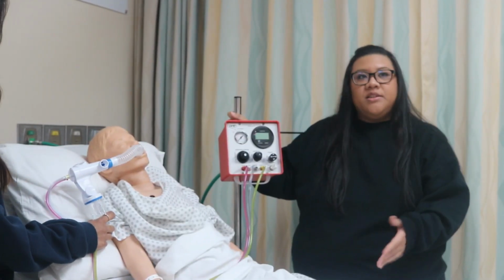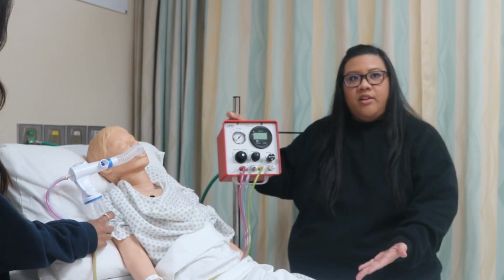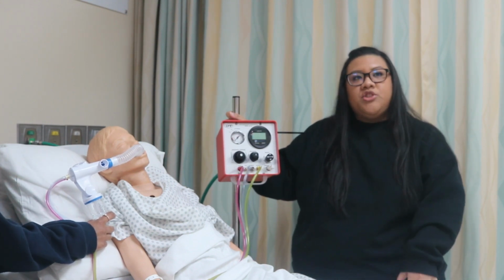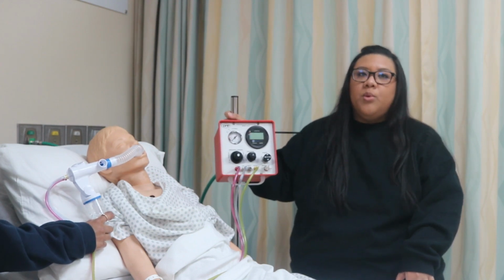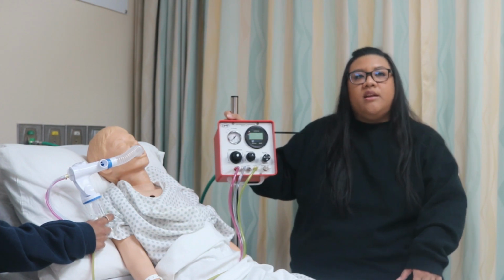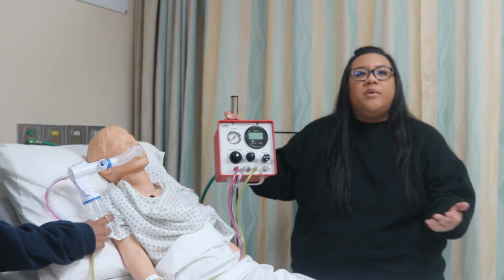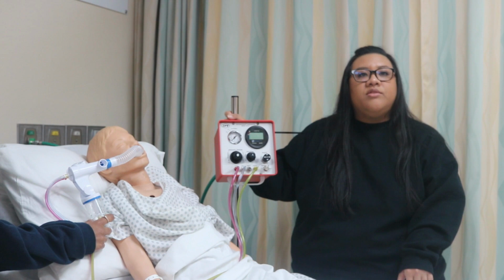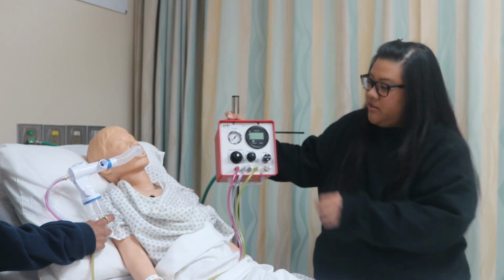Alright, so I'm going to give you guys a little demonstration. You want the patient to be in a semi-Fowler position. You want to instruct the patient to have a secure seal over the mouthpiece and breathe normally through the treatment. If the patient cannot maintain a tight mouth seal around the mouthpiece, they may use a mask. And also, you want to allow the patient to take a break so they can cough to help clear secretions and suction. So let's turn on the device.